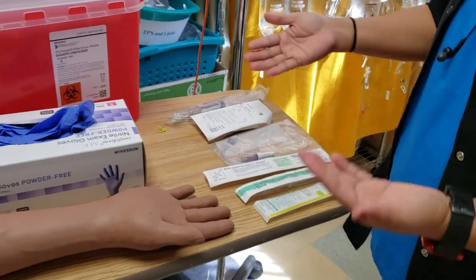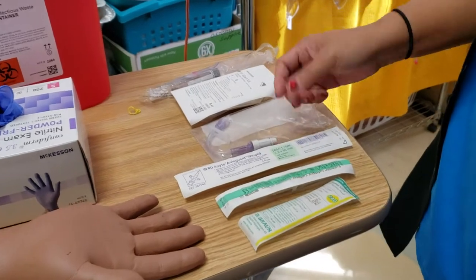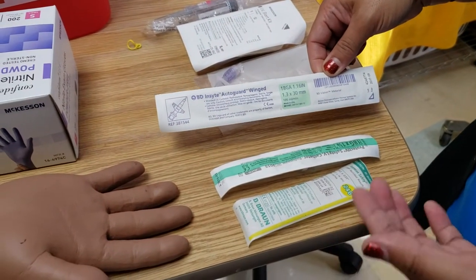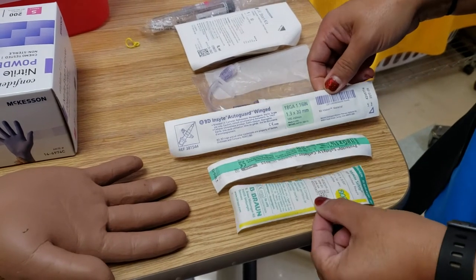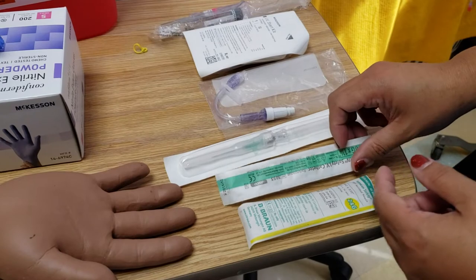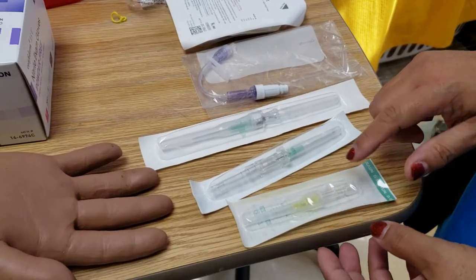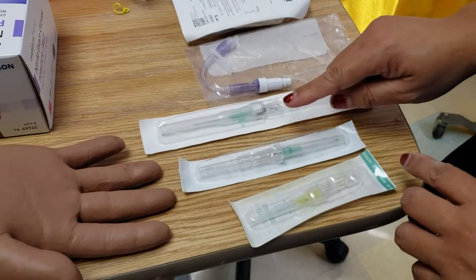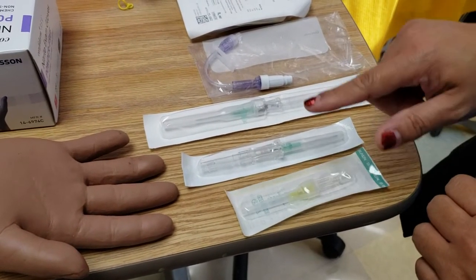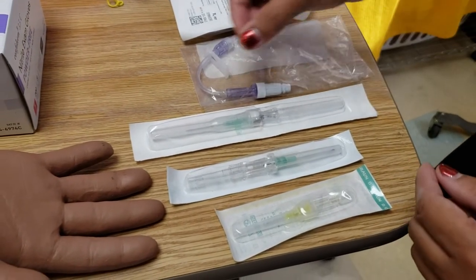To start an IV, I usually get all of my things together. We have three different kinds here. This is what they use at HMC, but I'm going to show you all three because we have all three types and they're all different. This is the newest one, this is the model prior to this one, and this is the oldest model. You might still see this one because they're still floating around, probably because they haven't expired yet.